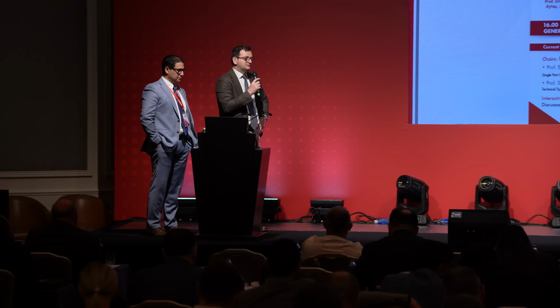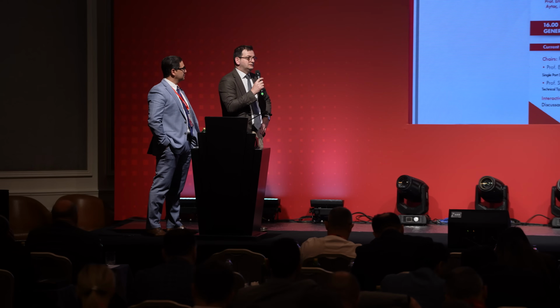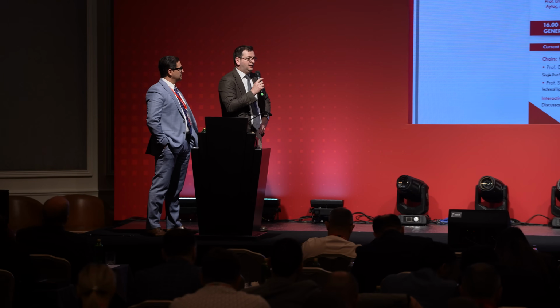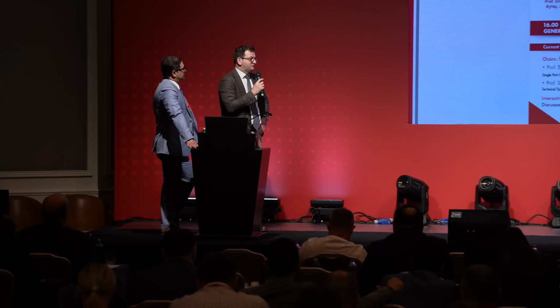But if I have the 45 millimeter stapling device with the single port, maybe we just do the rectal dissection with just the ileostomy site. An additional 5 millimeter area will be used for just the drain.